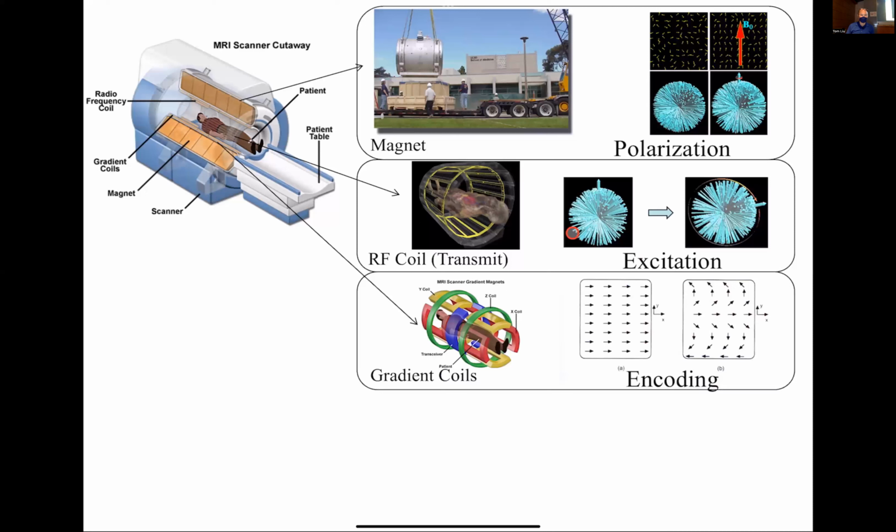Yes. Could you change from a constant magnetic field to a pulse, would that keep the precession going longer? Yeah, there are different tricks you can play. You can try to keep tipping it back in. In fact, one of the sequences we'll get into later in the course is something where you're always tipping the magnetization. That is a trick that people use.